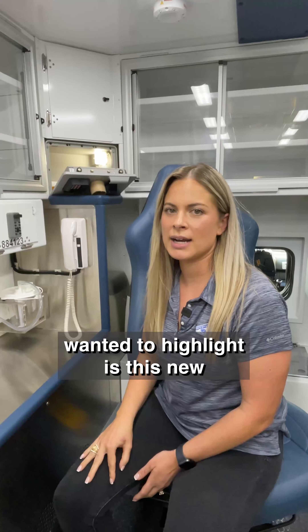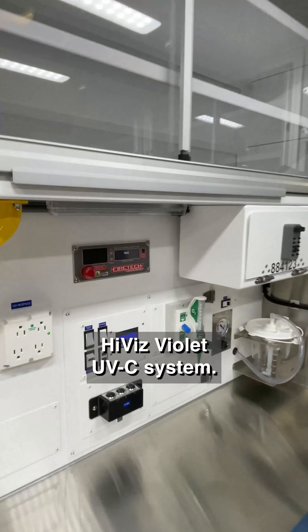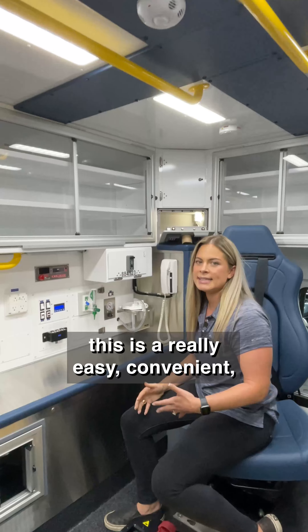Hey guys, today we're in the back of San Antonio Fire Department's latest Frasier, and one feature that is really cool that we wanted to highlight is this new high-vis violet UVC system.